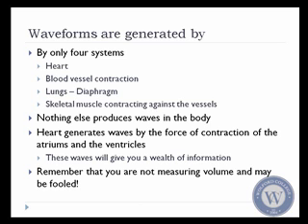But please don't forget the additional muscle that causes generation of waveforms, which we call breathing, but which also begins to affect other areas, including the spinal fluid space, the epidural space, or any area that is in direct contact with the chest cavity, through the actual diaphragmatic effects. So that's another thing you have to consider when you're looking at waveforms.